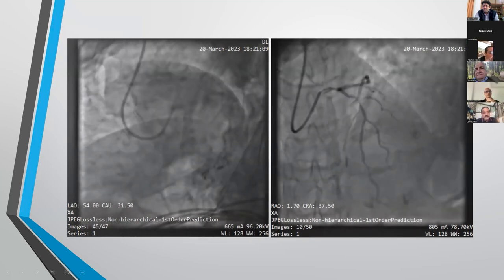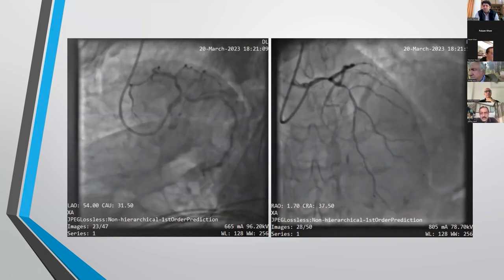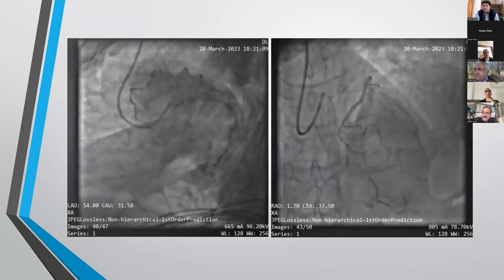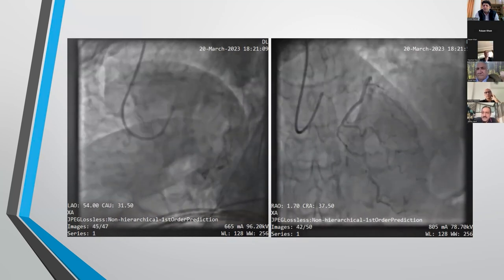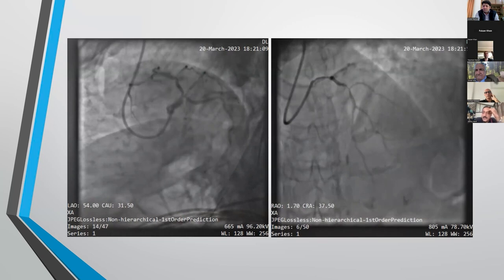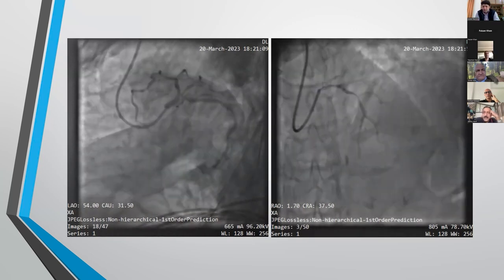I have been reviewing the literature and have almost written the guidelines and am trying to form a committee of ID and other people to go through that. Most of the places, especially if it's not a tubular thing, the most important thing is that it is properly re-sterilized, and there is a whole algorithm and criteria for how to do that. And if you do that, then it should not be a problem.